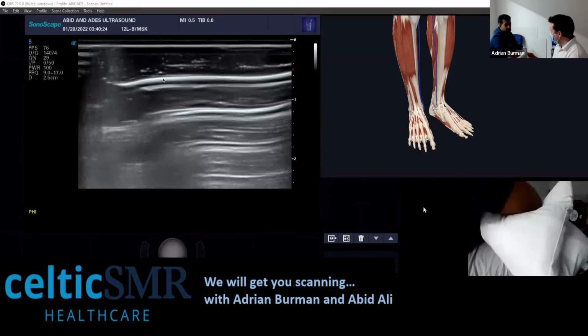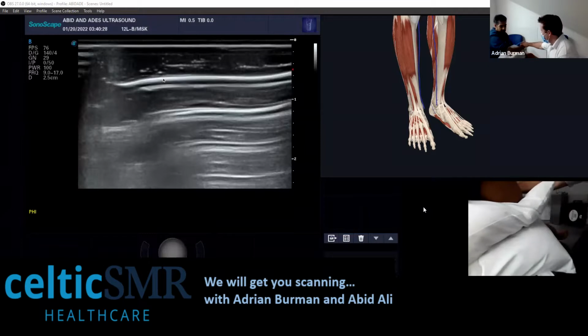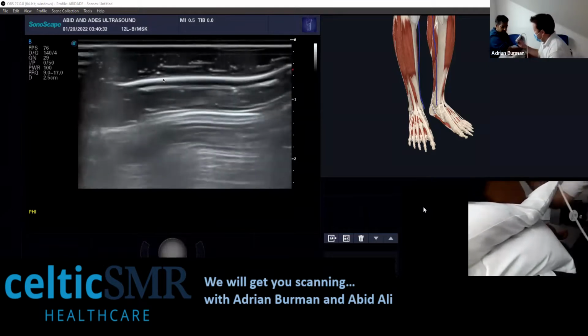Should we maybe start looking at those? It's quite common this time of year, isn't it? Yeah. COVID, a lot more racket sports, so tennis and golf elbows maybe. Yeah. A bit more common.